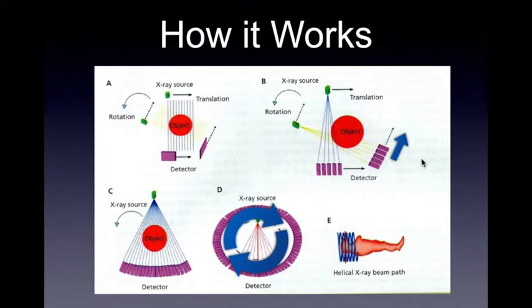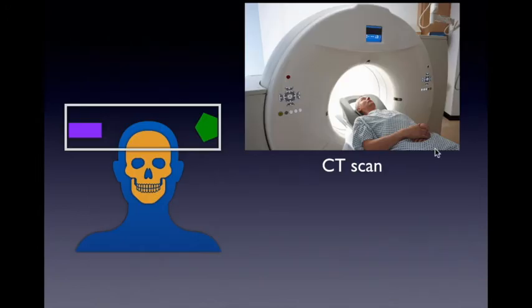Computers, especially newer computers now, had to simply collate all of these images and compound them into a single image, literally taking all of the different pictures taken from the object and putting them all together, pasting them in order to get a picture of the entire patient.